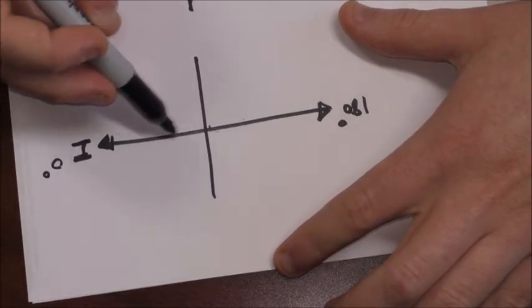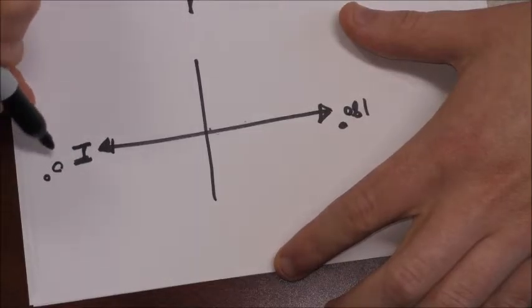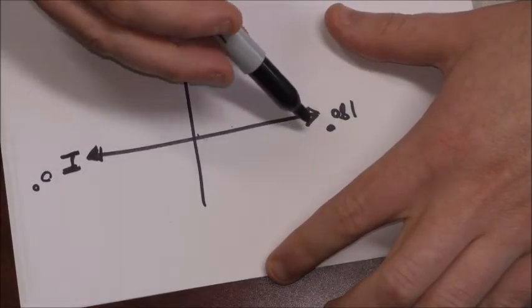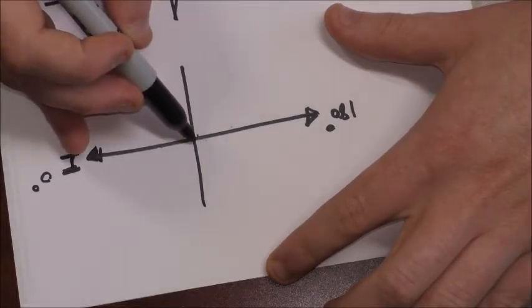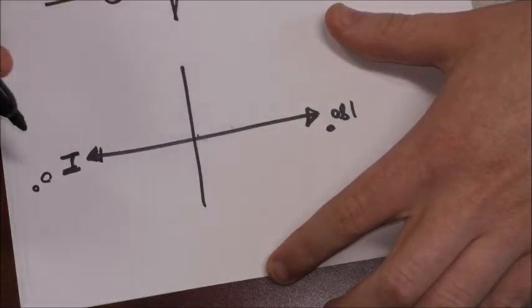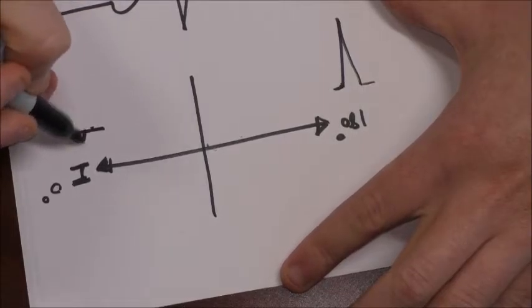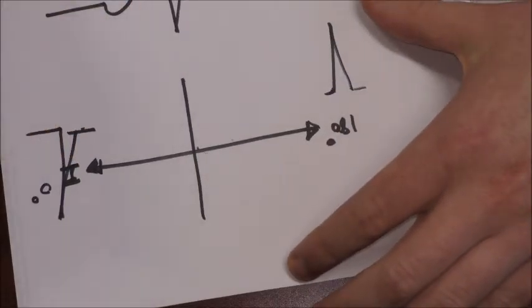So if I have a wave of depolarization traveling directly at me, positive ions flowing out towards a cathode would be purely positive deflection. And because the person standing over here, or the electrode on this side, sees the exact opposite of that, meaning that the wave of depolarization is traveling 100% away from it, it's going to be a negative deflection. So if I think about it over here, it would look something like this, versus over here, it would look something like this. So it should be the exact reciprocal of it.